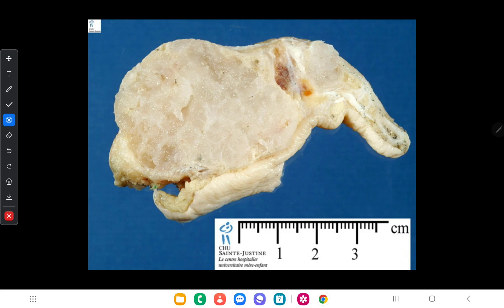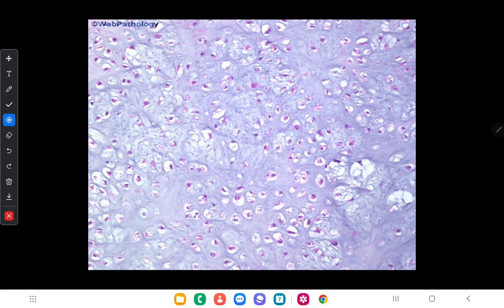Here is the gross appearance of chondroma, which shows a lobulated cartilaginous mass. In the microscopic view of chondroma you can see lobules of mature cartilage tissue.